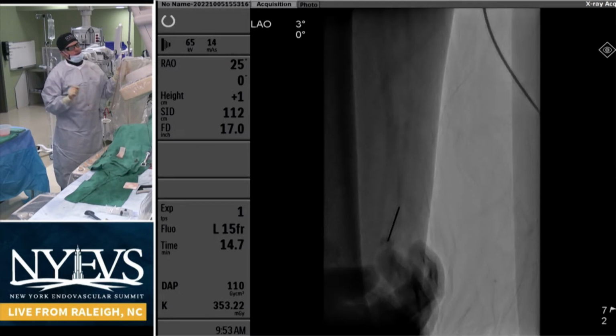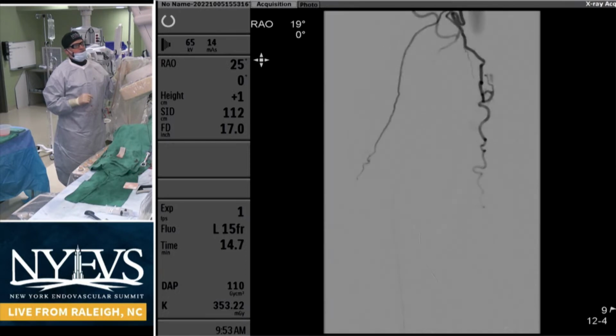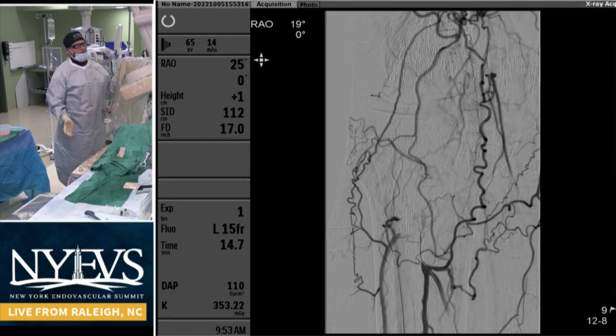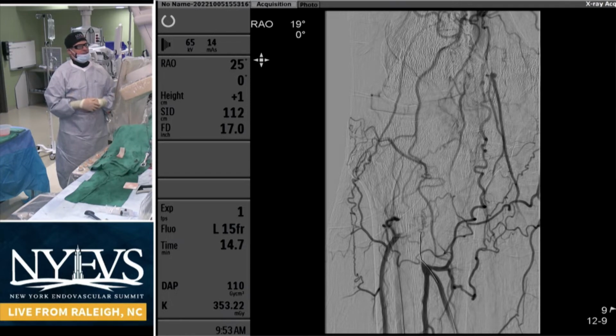So this is my micropuncture needle, just showing you me sticking. Then I do it angiographically, and then placed the wire up. I placed a Rango sheath in from below. It's a 4 French sheath, 3 French profile, much like a Slender, and then took an array of wires.